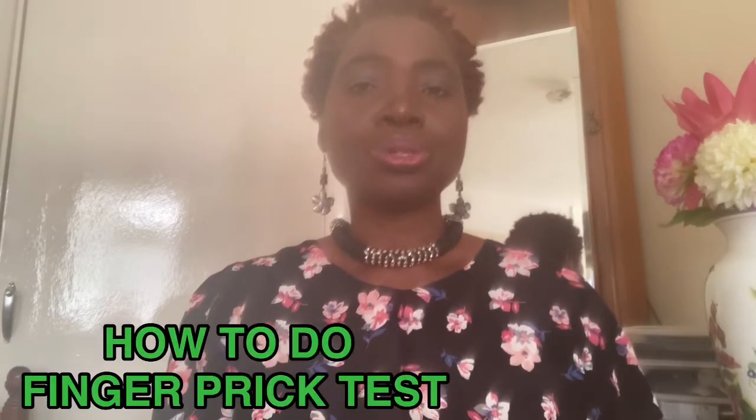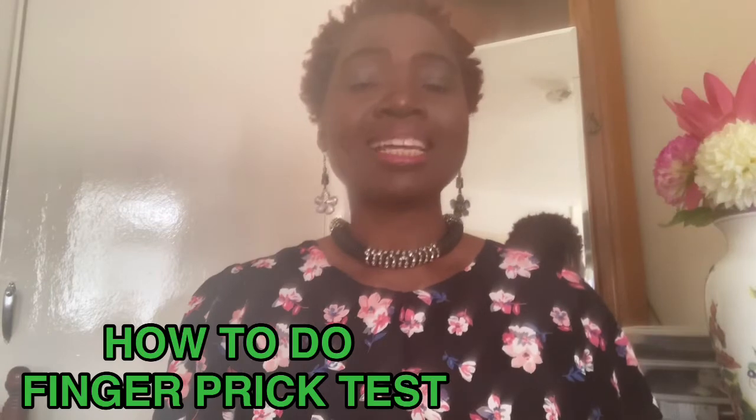Today I'm going to demonstrate how to do finger prick tests. Finger pricking is how you find out what your glucose level is at that particular time. Please watch as I demonstrate the simple steps on how to test your blood glucose level in the right and safe way.